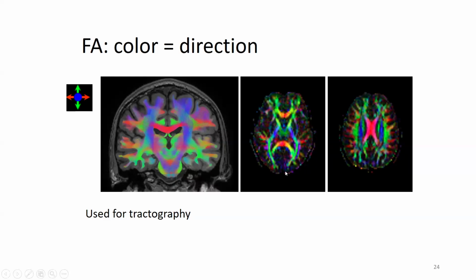So my visual cortex should be about here, my eyes are about here, so it's very nice if they can communicate with each other, because the input of my eyes should go to the visual cortex. So there are fiber bundles which really go from the front of my head to the back of my head. So the green ones here, of course there are even more from front to back, but definitely also the visual tract is going from my eyes to the visual cortex. So that's what is in green.